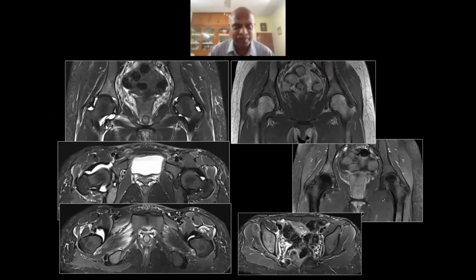When we've done the imaging, what we see is joint effusion. We also see there's a lot of periarticular edema involving the muscles around the hip joint, and there's also involvement of the bone with signal abnormality, both on your STIR images as well as your T1 weighted images, that shows enhancement. Now, the reason to put this case is that seeing signal abnormality on T1 weighted images should not always make you think about osteomyelitis. You can also have reactive edema, which will manifest itself as hypointense on your T1 weighted images, just that when there is osteomyelitis, this signal intensity is a lot more pronounced than when it is in reactive edema.